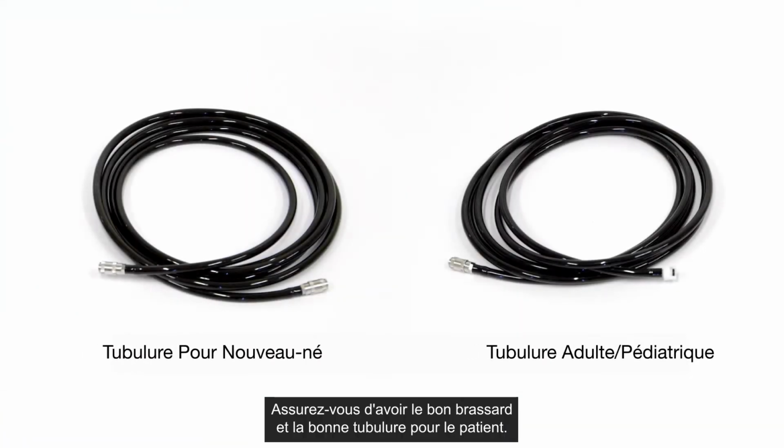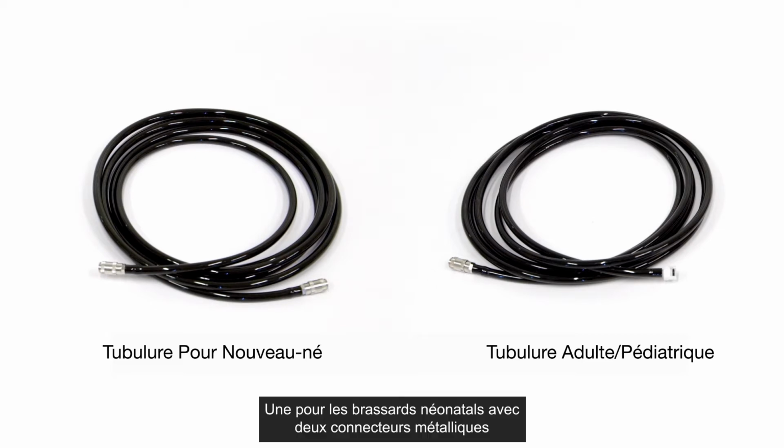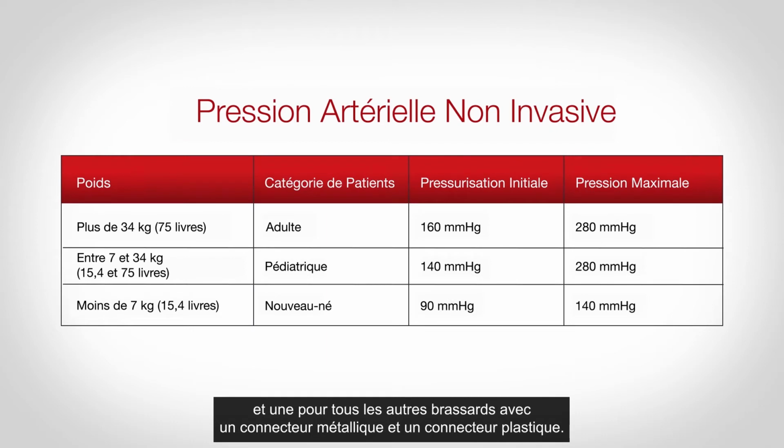Ensure you have the correct cuff and hose for the intended patient. There are 2 types of hoses. One for neonatal cuffs, which has 2 metal quick connectors, and one for all other cuffs, which has 1 metal connector and one plastic connector.